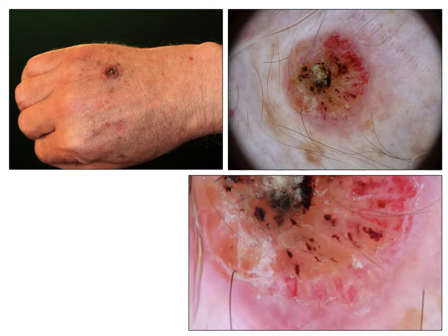So you have these vessels, and around these vessels you can see a whitish halo that corresponds to the epidermal component. Then keratin becomes oxidized and the color changes. It's not white but orange. And when this oxidized keratin is exposed to the air, the atmosphere, then it becomes whitish. Like the squames you can see in the center part of this lesion.